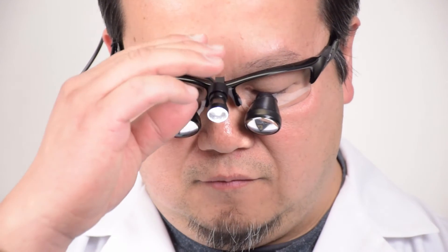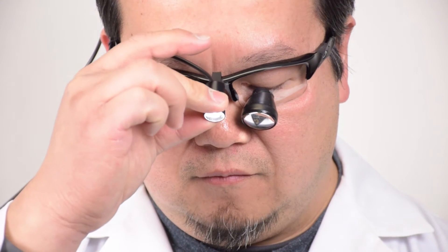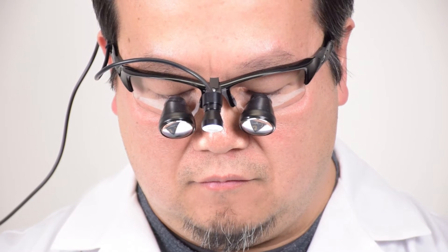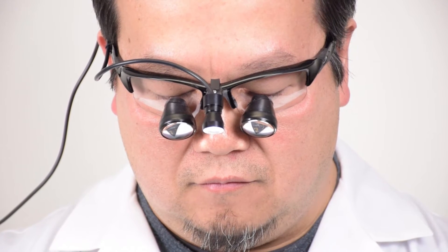Please note: throughout these instructions we will show the light on during adjustment in order to observe the beam. If your headlight becomes too warm to touch comfortably, please turn off your headlight and wait until it cools before you continue adjustments.